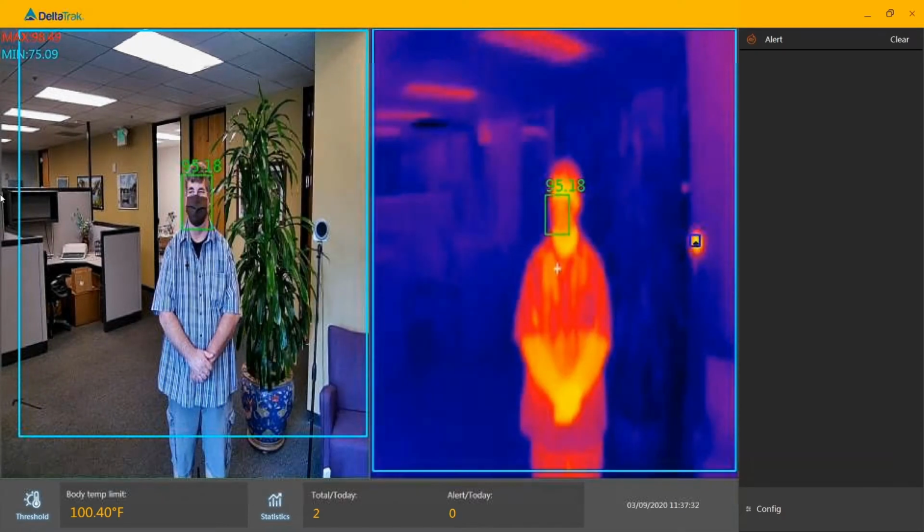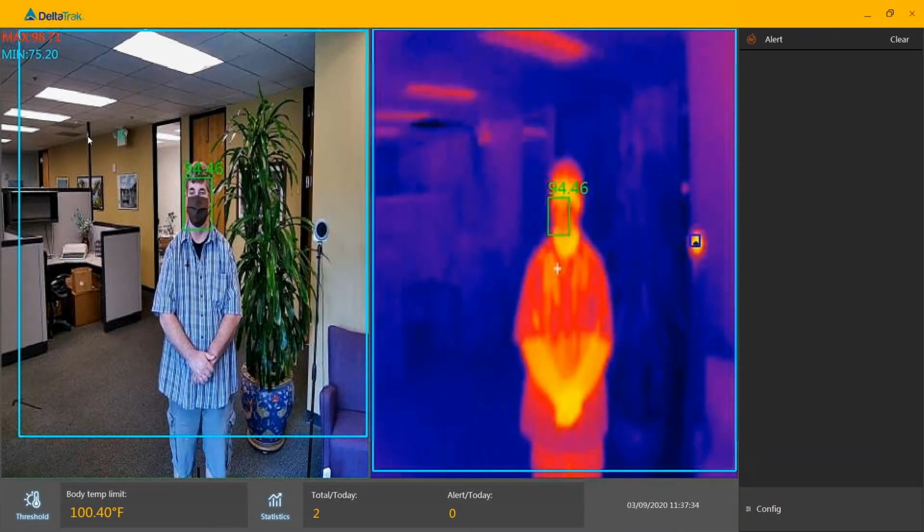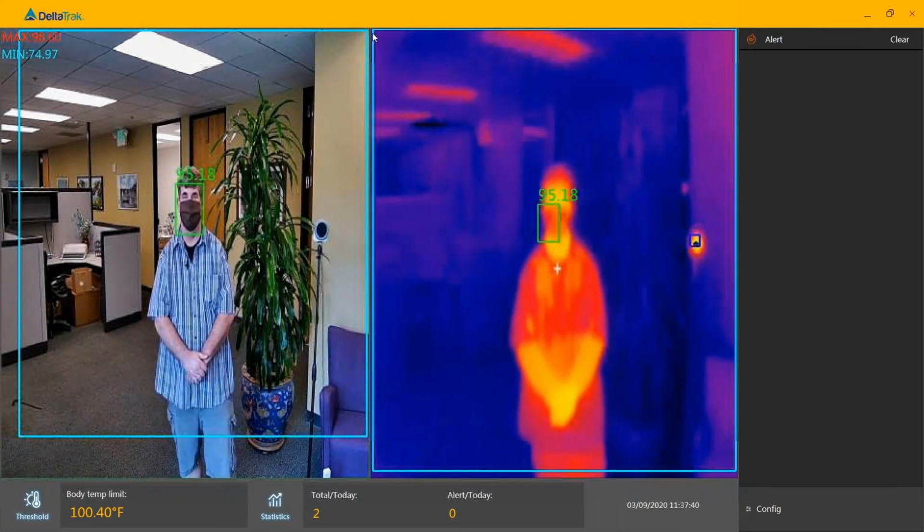Close the config screen to check or set the borders and edges to make sure the subjects being measured are in the camera's focal view. Note, we are still in the mode state while performing this operation.